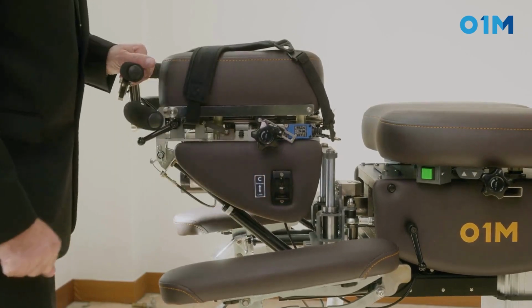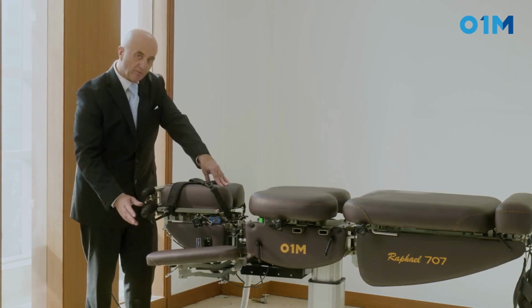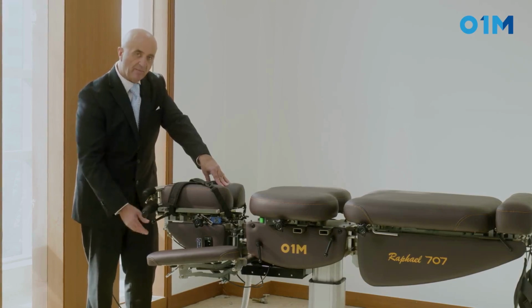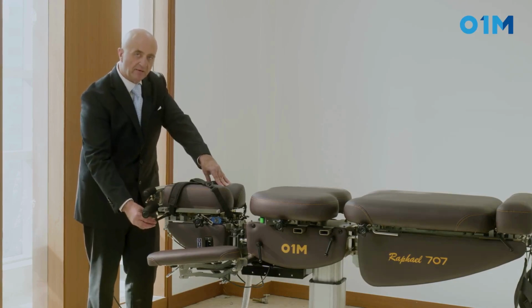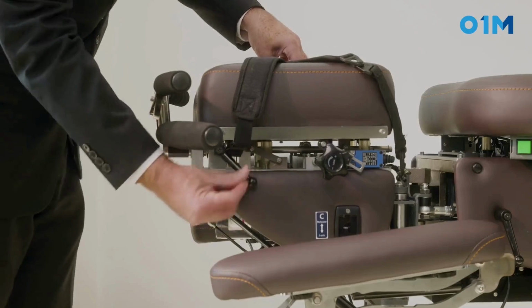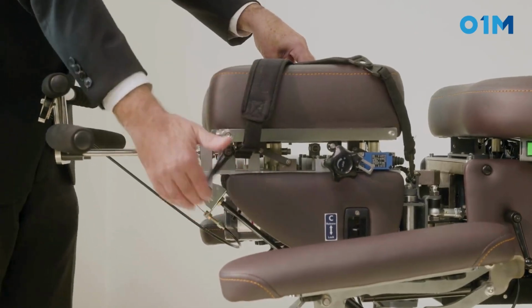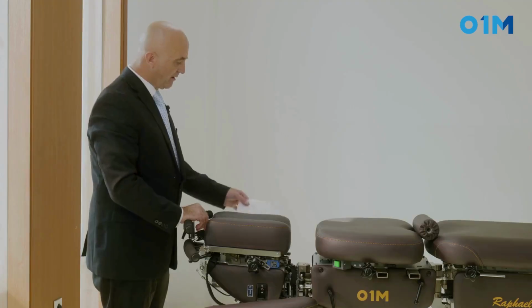Lock it again. The patient can use those handles in decompression technique, and you can set up the distance of the handle from the table to adapt it to the patient's arm length. So you unlock this segment, and one finger pull it out, lock it, then we have it strong.